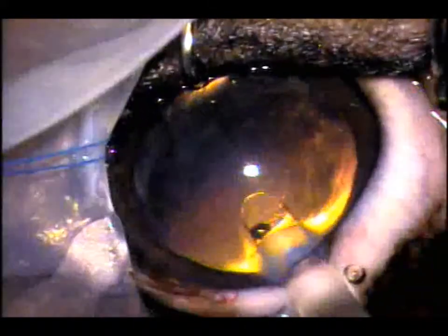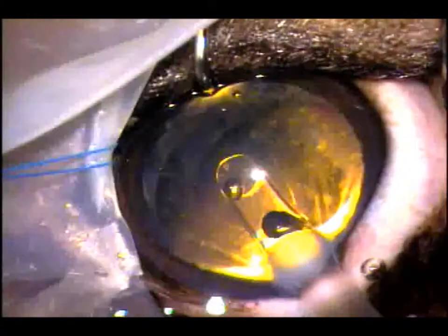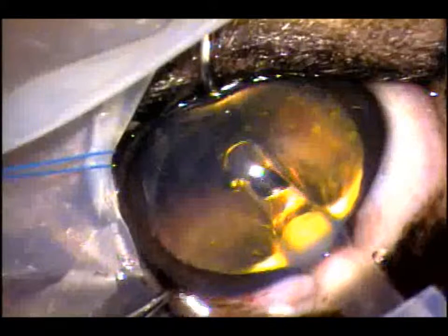After implanting the capsular tension ring device, we can go ahead and implant an intraocular lens. This is an injectable or foldable acrylic lens.